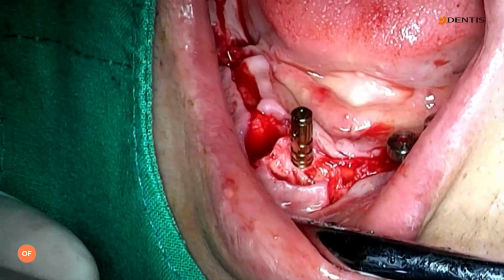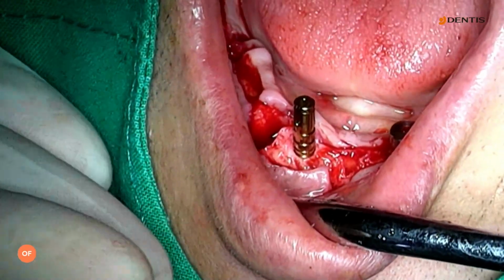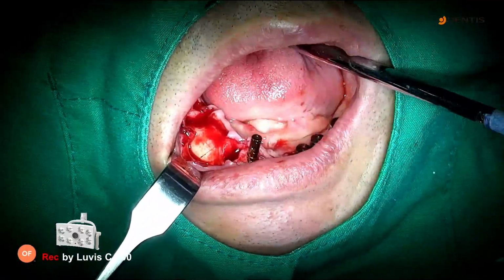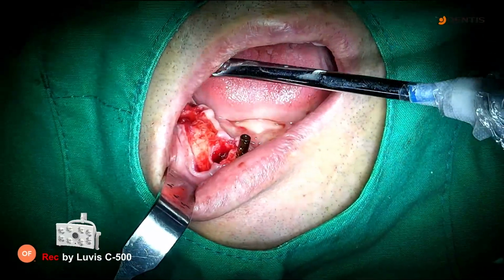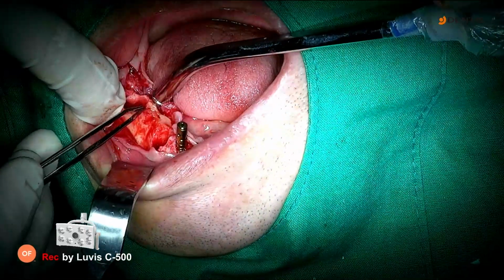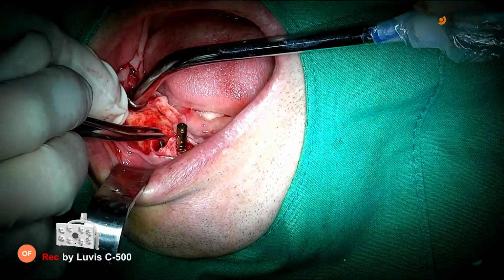As I mentioned many times, this is only the analog method, right? But without the base of this analog method, we cannot go to the next step. The full mouth surgery definitely requires this kind of analog surgery first. And then at this time, I want to change the lower right side, a medial cantilever will be better, because the initial stability is not proper.